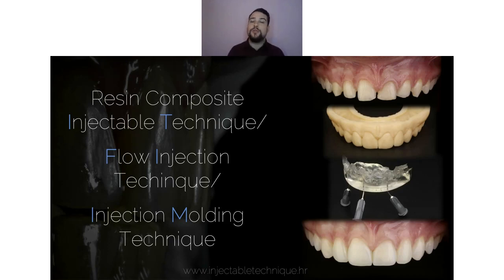Okay, here we need to have suitable patient with indication of placement composite veneers. We need to have well-prepared wax up, which can be analog or digital, whichever protocol you are usually following. We need to make transparent silicon index based on this wax up, and to make small holes inside on the incisal edges through which we are later on going to inject flowable composite directly in the mouth of the patient, directly on the teeth, and then light cure. That's why we need to use transparent silicon index.